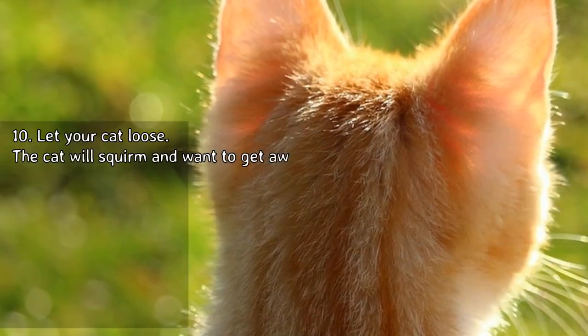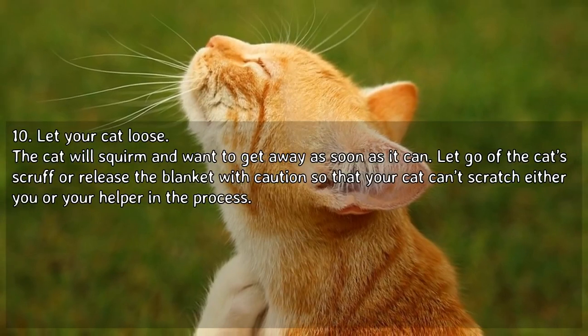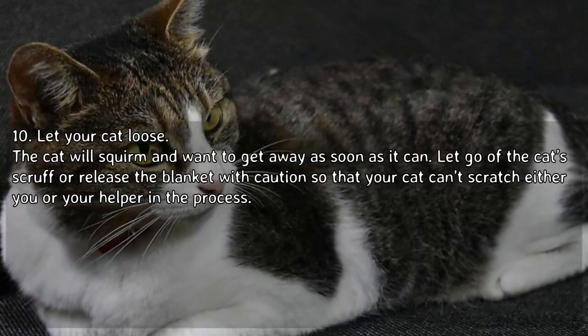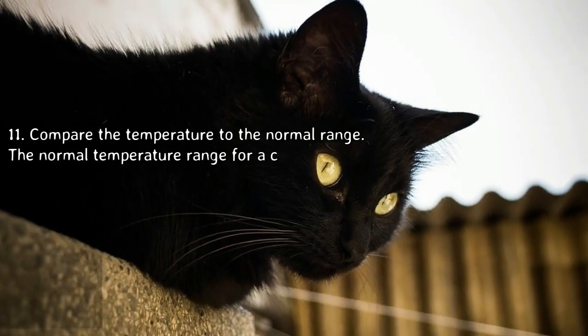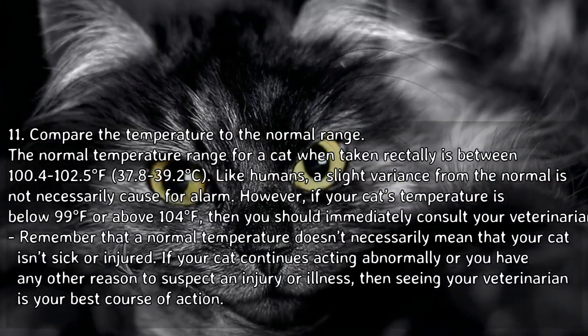Let your cat loose. The cat will squirm and want to get away as soon as it can. Release the cat's scruff or release the blanket with caution so that your cat can't scratch either you or your helper in the process.